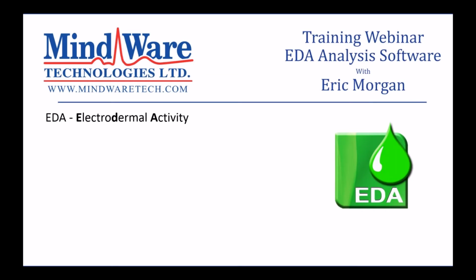So what is EDA? EDA stands for electrodermal activity. And throughout history, simply due to the way the science has evolved, the different techniques that were used to acquire EDA, it's gained a number of names that are sort of used interchangeably in the publications. So you might have seen this labeled as EDR, electrodermal resistance, or GSC, galvanic skin conductance. Even us at MindWare occasionally refer to it as GSR. But really, they're all talking about the same type of measurement, and that is EDA, electrodermal activity.